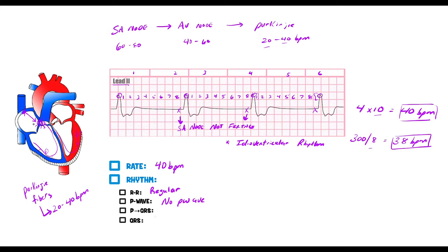There's no P wave — it may be hidden somewhere within the QRS complex, but we can't assume that. Since there's no P wave for every QRS, there is AV dissociation — no strong connection between the atria and ventricles. Now looking at the QRS complex width: marking where it starts to where it ends, counting the boxes — I've already got four boxes, so this is definitely wide.